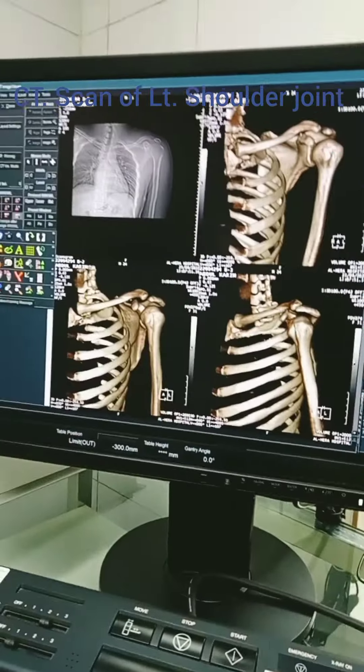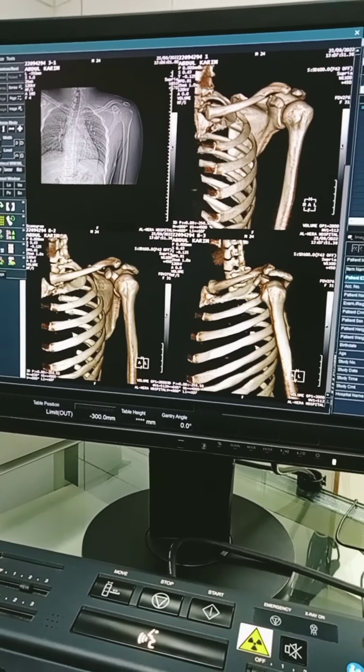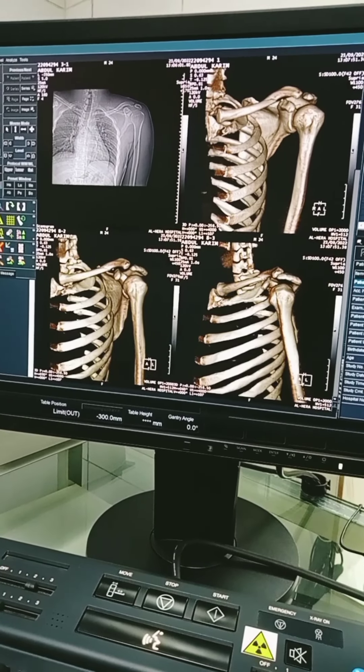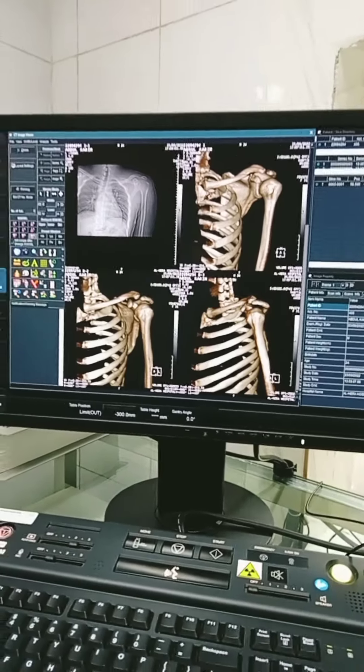Supriya Medigra Technologist. Assalamualaikum. I am going to show you a CT scan of the left shoulder joint — a CT scan with 3D image.